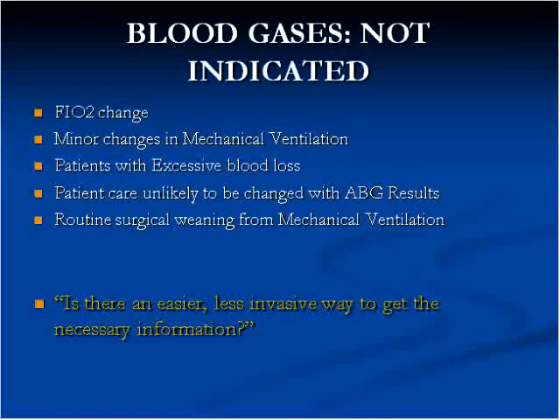And I think probably most of the good protocols out there come from surgery, and in cardiac surgery in particular. We've shown that we can get patients off mechanical ventilators without blood gases, with many fewer blood gases than we used to. So those are reasons, and I will expand a little bit upon that as I move along.